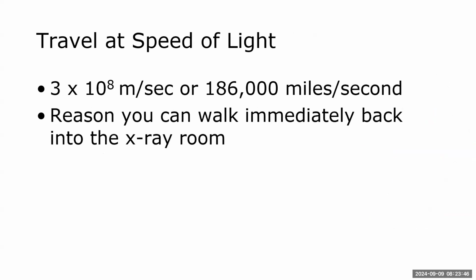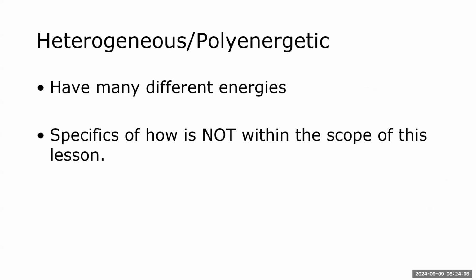They travel at the speed of light. So that is the reason you can walk immediately back into the X-ray room. As soon as you make the exposure, you can walk right back in. They're not still flying around in there. So you do need to know that the X-rays travel at the speed of light.